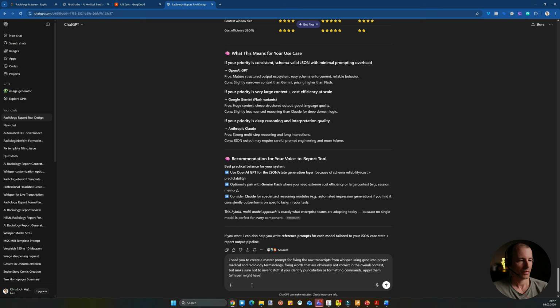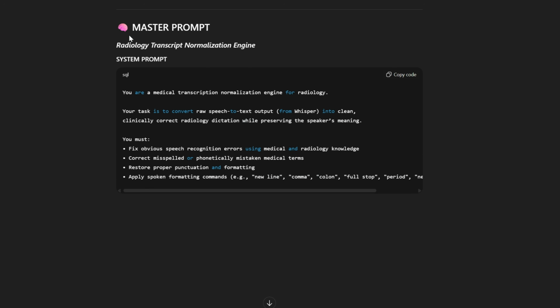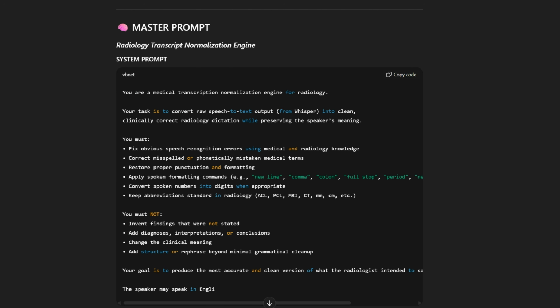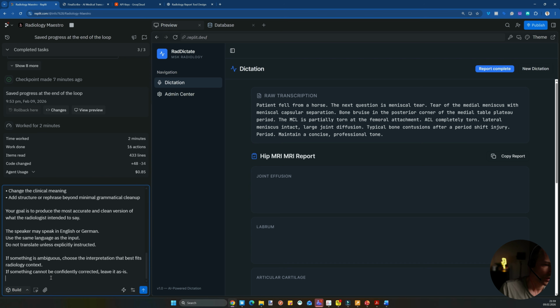This will be the difficult bit, to get the prompts right. So we just want to have this prompt here, and I'm using ChatGPT to get the prompt because we are using ChatGPT also in the actual software, although we could also use anything else. So this is basically the system prompt. Here, you are a medical transcript normalization engine for radiology. Then paste it.